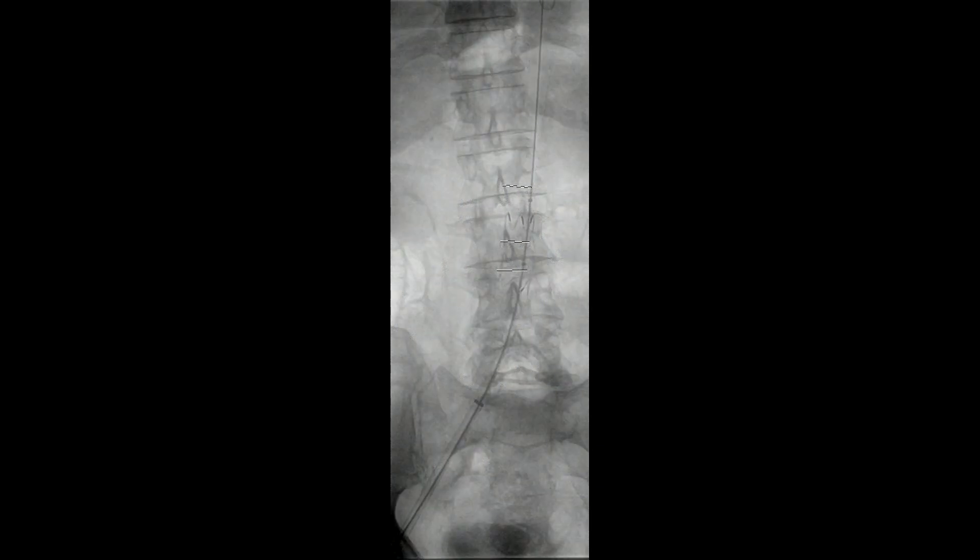Once we're happy with this, the balloon is removed. The pigtail catheter was put back in place and we then shot a completion angiogram. Prior to doing this, we placed two Proglides in the right femoral artery. The plan was to do this all percutaneously. The balloon was then removed.